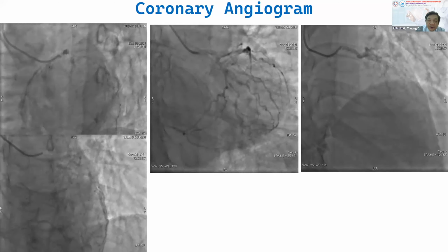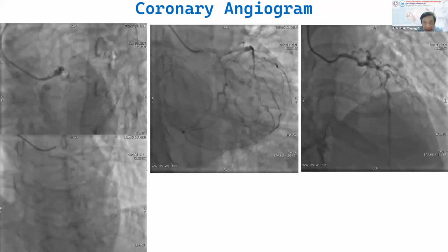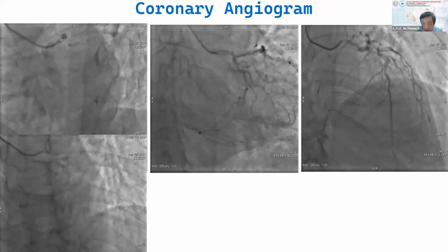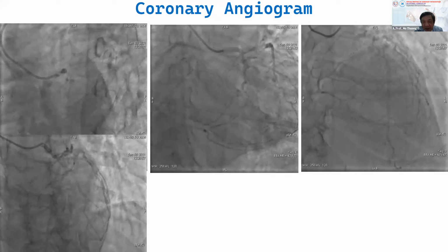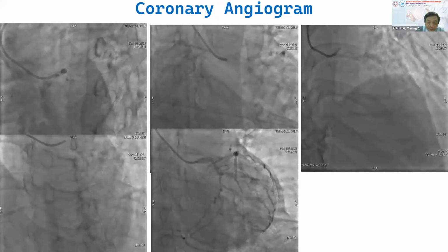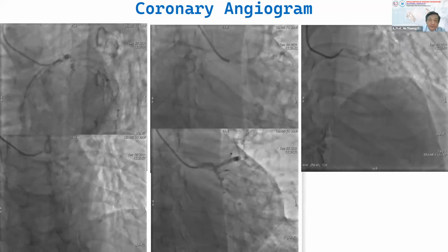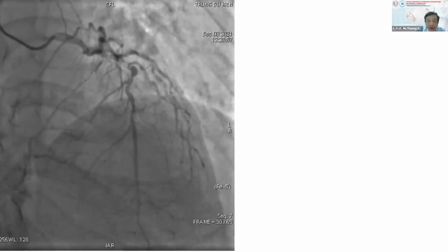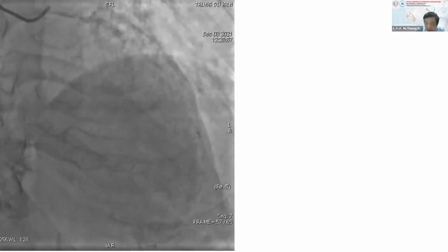In the coronary angiogram, when I look at the left main and ostium of the left main, it looks not clear, not like severe stenosis. I think there is some plaque in the ostium of the left main, but I did not pay much attention to it. But in some views there is a lesion of the ostium of the left main. And the patient has a CTO of the right coronary artery, so there is less remaining vessel for us to do the PCI.